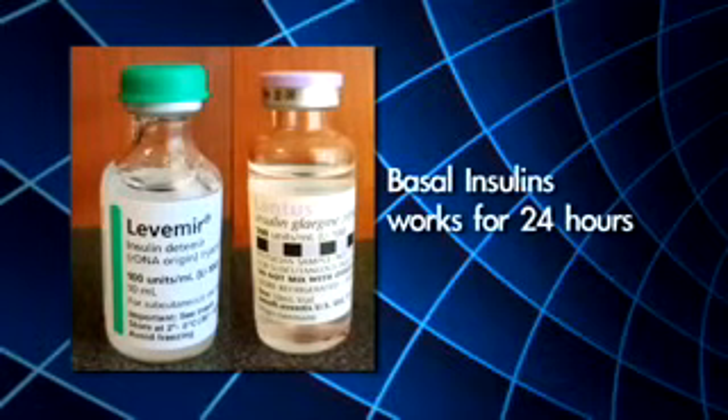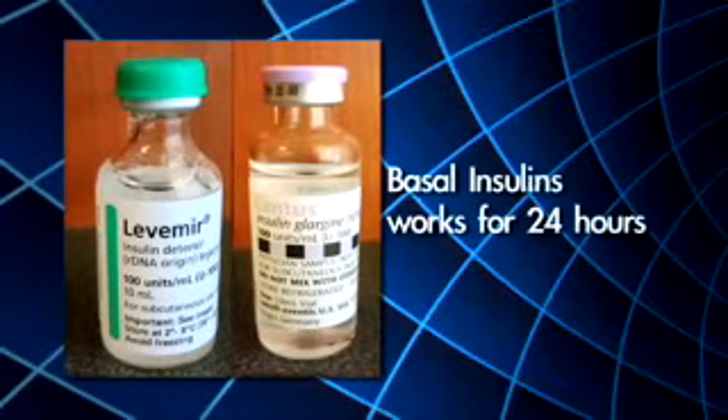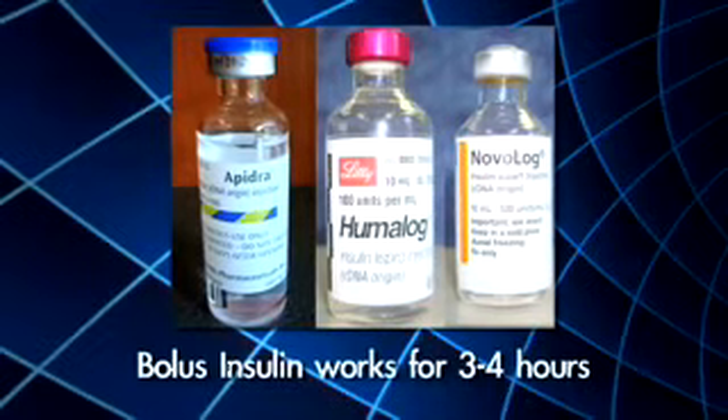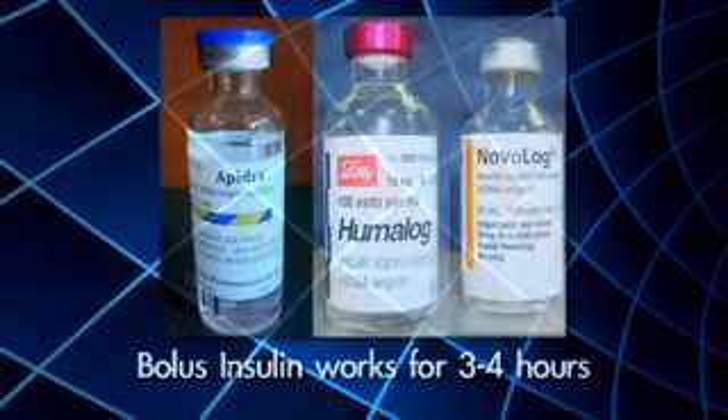There are many types of insulin, and many people take two types. One is long-acting, the other is rapid-acting. Your doctor will tell you what kind of insulin to take, how much to take, and when to take it. Most people with diabetes take insulin with meals and at bedtime.